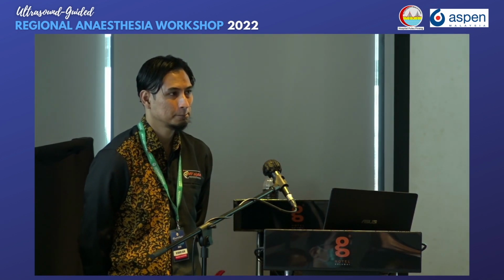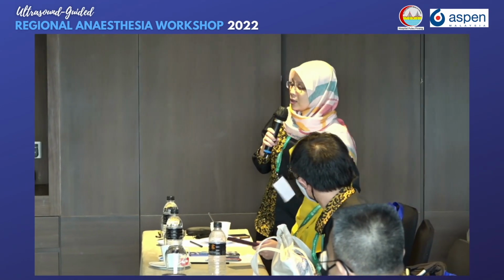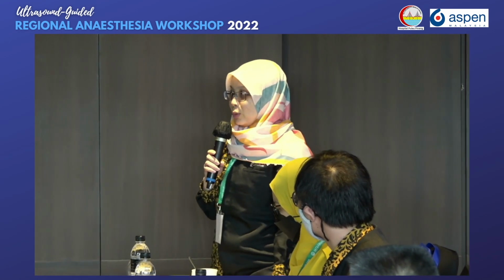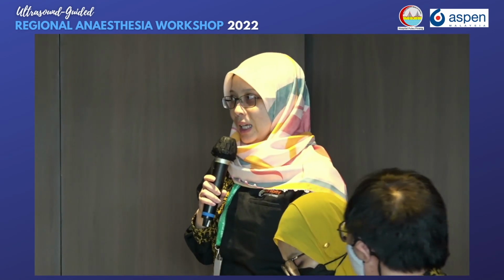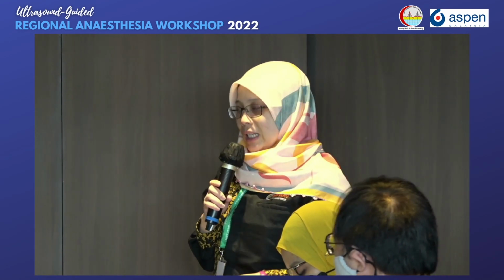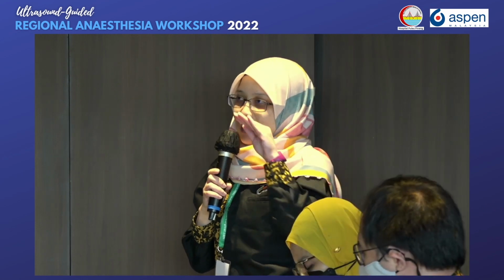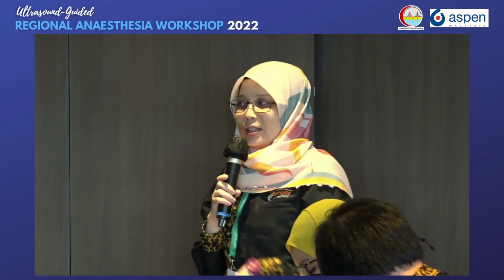Just now the concept is a bit wrong because the question itself is wrong. We don't supplement PECS2 to PECS1. PECS2 is basically PECS1 plus the second injection. PECS1 is only a single injection. So the question is a bit wrong just now. Okay?